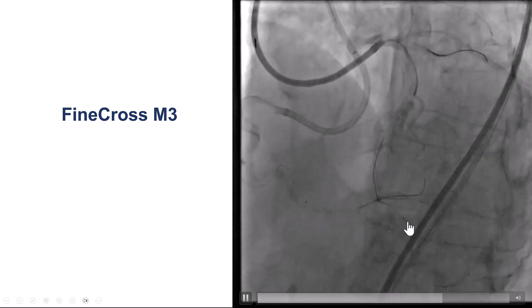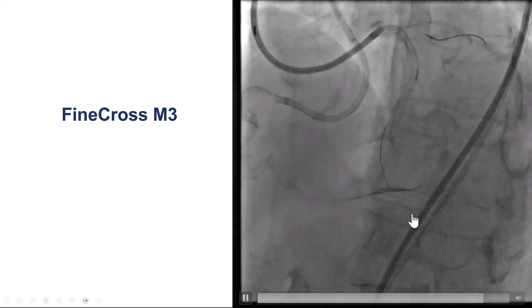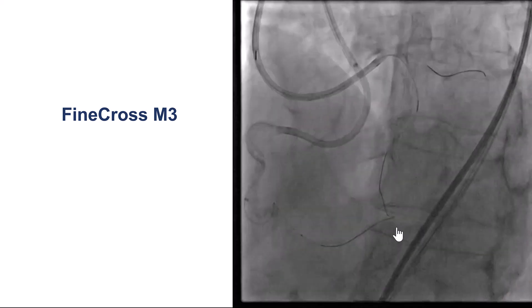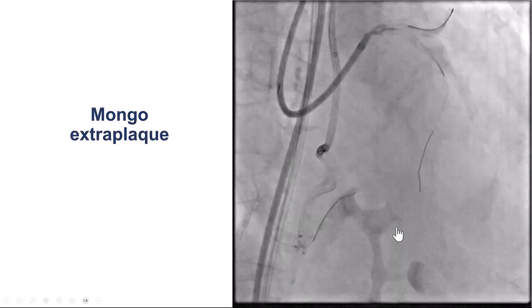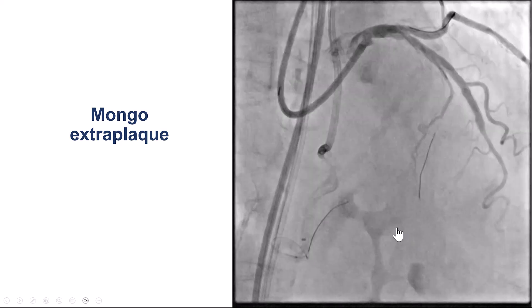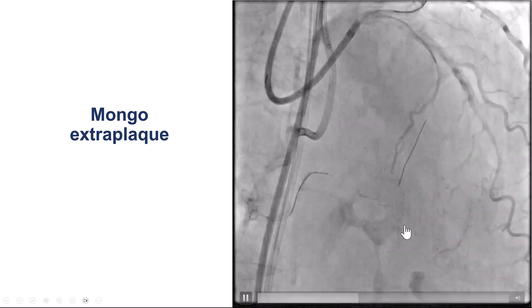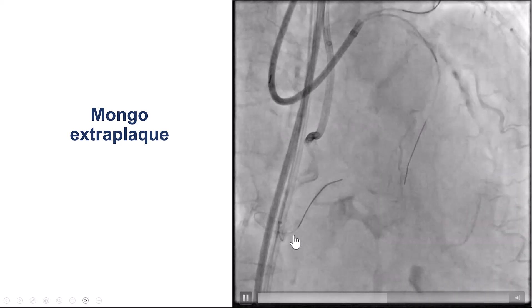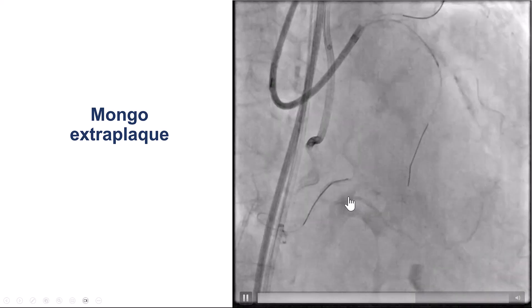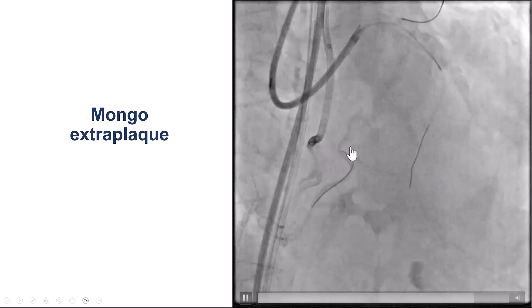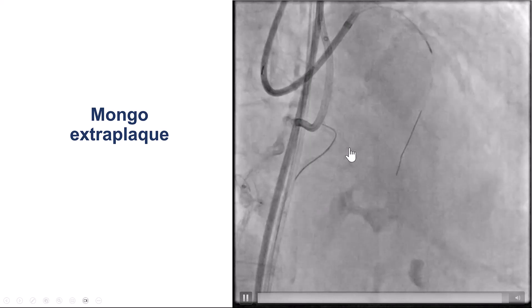Unfortunately, as the contralateral injection shows, the wire we have is not in the true lumen but is actually extraplaque, and therefore we need to perform re-entry. This can be seen more clearly here — the wire is clearly extraplaque.